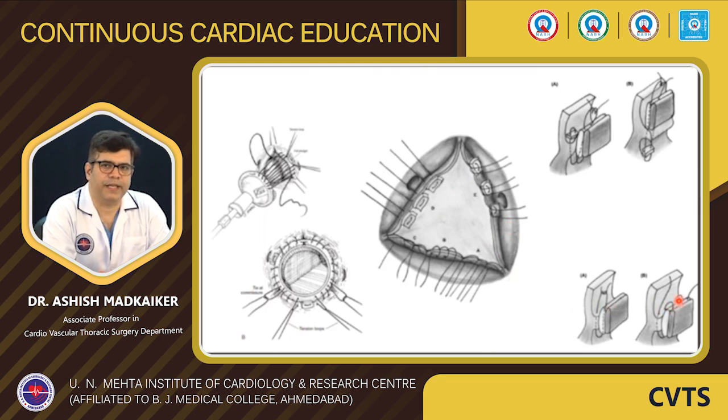The other technique which is important is the continuous technique. Again here continuous stitches are taken from the annulus and the sewing ring, starting from the nadir and then progressing towards the commissure. And then we finish one cusp, then the second cusp, and then the third cusp, and then the valve is parachuted down and then tied at the commissures. Again, we should be very careful about the quality of the annulus in this technique. And also, when we are sliding the valve down, we should be careful that we do not cut any suture through the annulus. With these precautions, this is a good and fast technique. However, if we don't select the patients properly, then there might be incidences of high paravalvular leak in this technique.